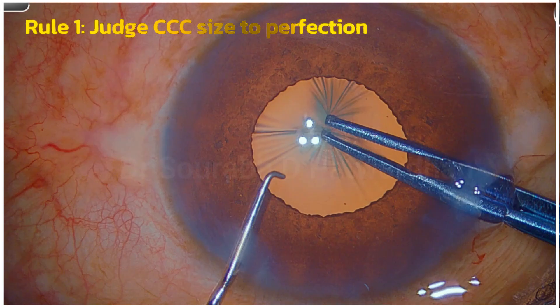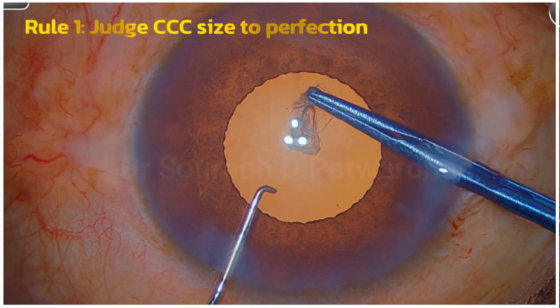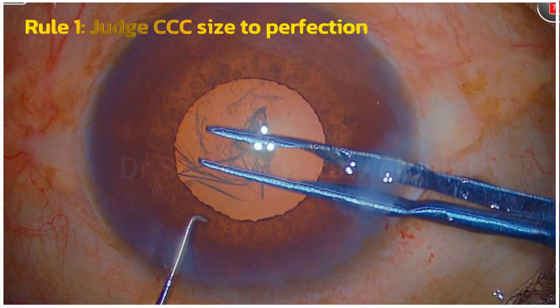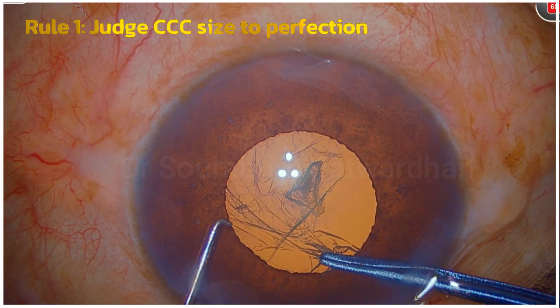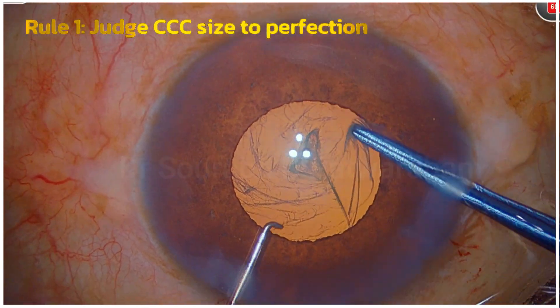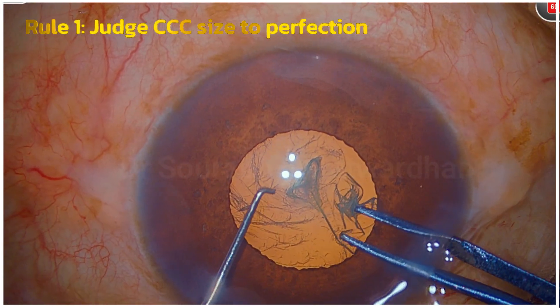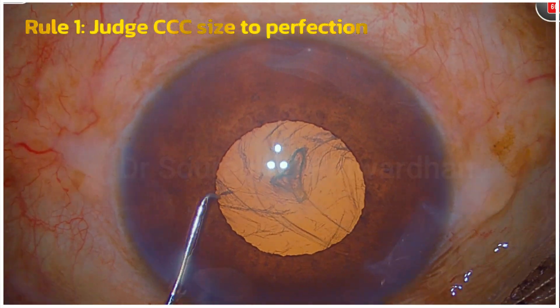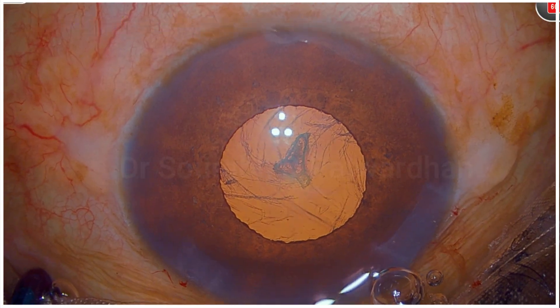A good OVD here makes it simpler, and of course experience. I am grabbing the capsulorhexis tear more often, every two clock-hours, and then I am going to complete it under the pupil at the end. You can see the pupil is a little bit constricted as I went around, but I know that the CCC size is good here.